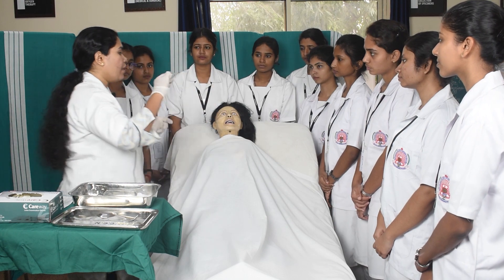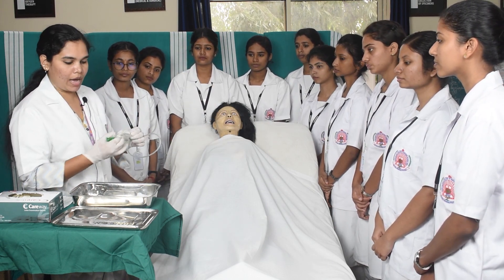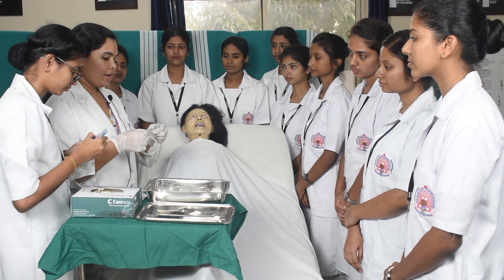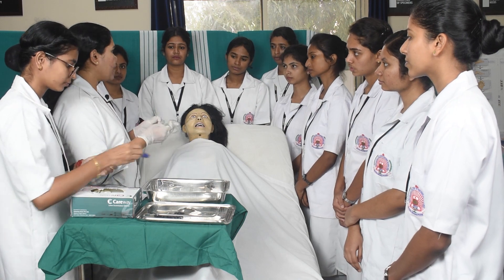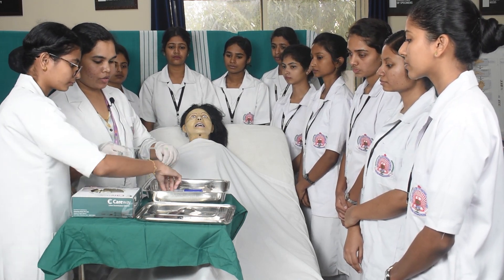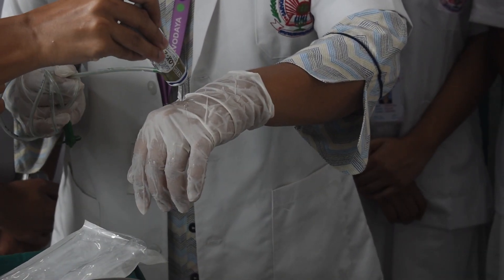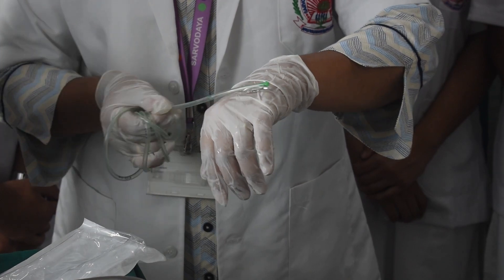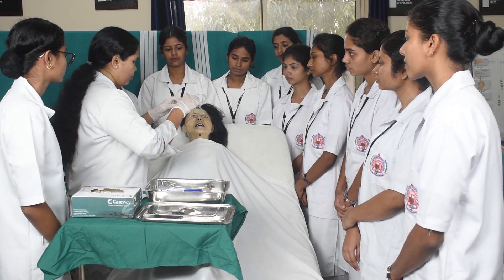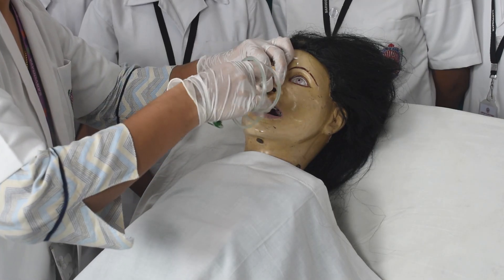After taking the measurement, you have to mark it with a marker — mark the length of the tube. After that, lubricate the tip of the ryle's tube with lubricant jelly or lignocaine jelly, approximately 2 to 4 inches from the tip.